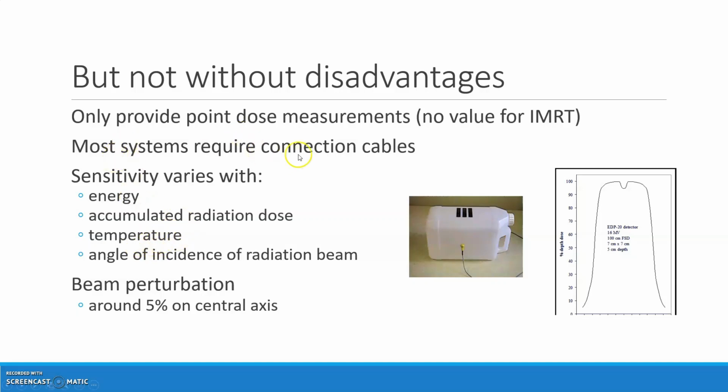They do require connection cables, which isn't really a problem. But in the old days, they used to trail across the floor, go through a duct in the wall into the area outside the room, and it'd be easy to fix them to the patient and then trip up over them on the way out. Most of them nowadays, as you'll see, are connected via ceiling mounts.